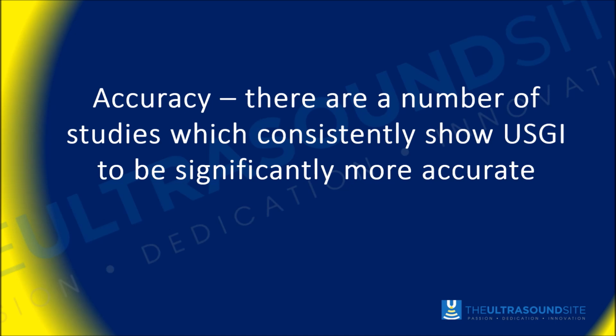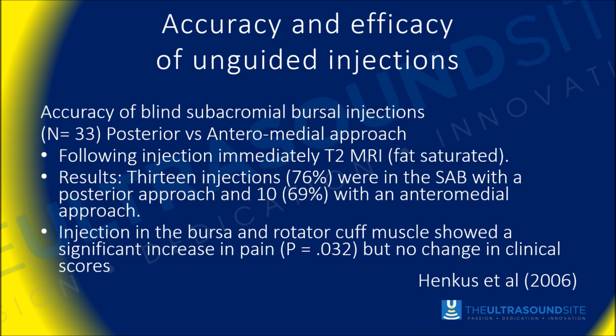And you can see from our previous images and demonstrations of an ultrasound guided injection that, provided one is trained in ultrasound and knows the anatomy, is able to identify the relevant anatomy, and has the appropriate skill, the proprioceptive skill, to guide the needle towards the target structure that's being seen on the ultrasound, it's reasonable to believe and to justify the fact that ultrasound guidance does indeed significantly improve the accuracy of most injections, and that's been, so to say, not proven but justified and demonstrated in a significant number of studies.